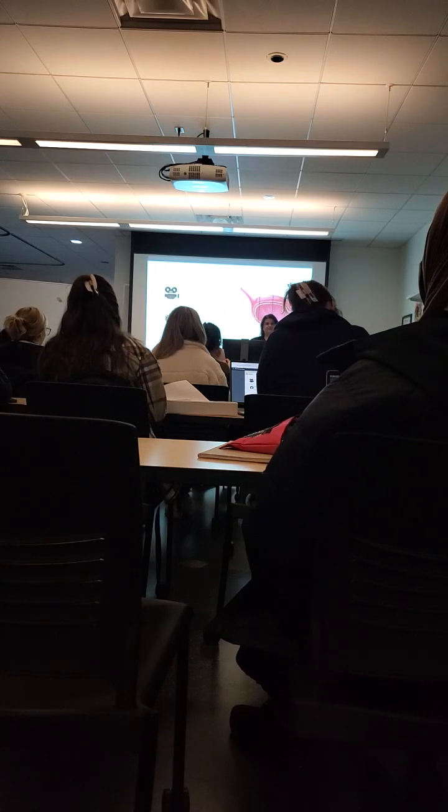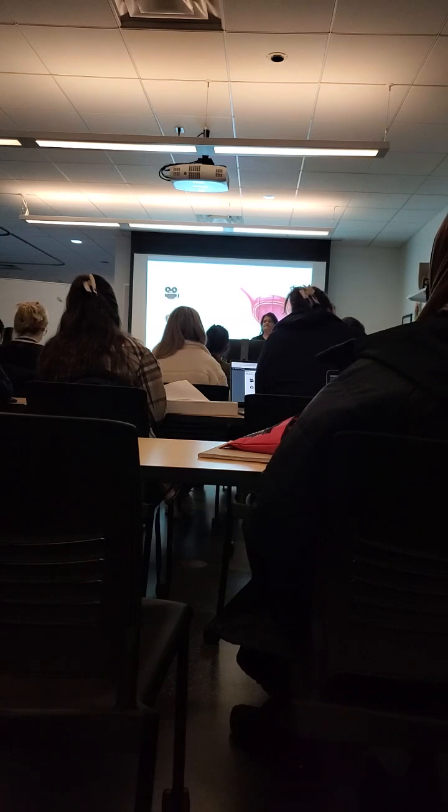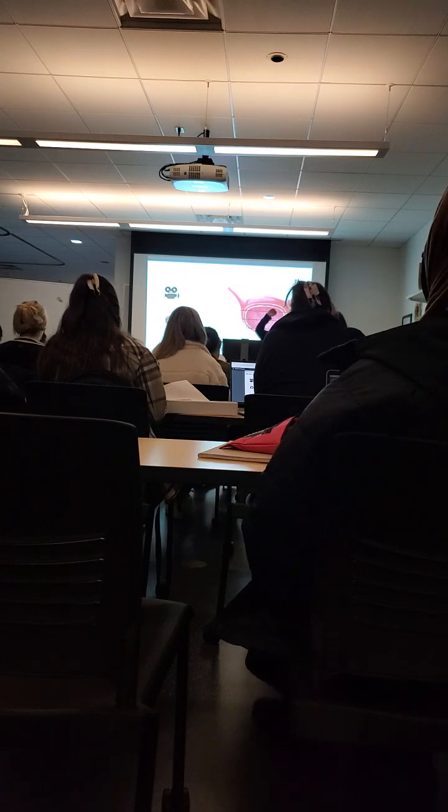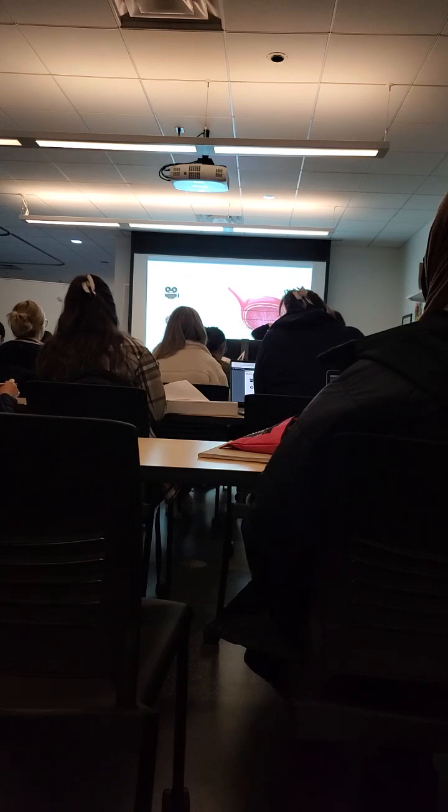Right? Because we're in midline. And then you're gonna take your images, mid and left, that is gonna be in sag. In transverse, you're gonna go superior to inferior, then superior, mid, inferior, come back, and that's where you're gonna put your color on. Your color's gonna go on mid, or sometimes inferior, depending.